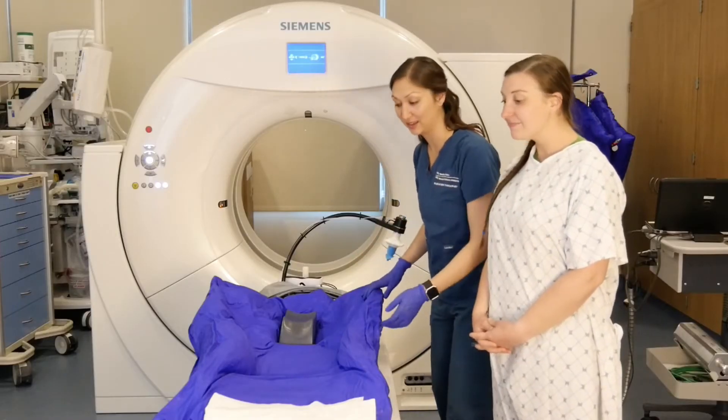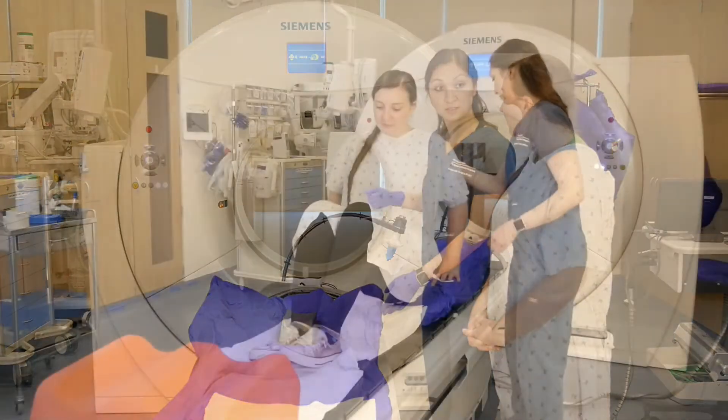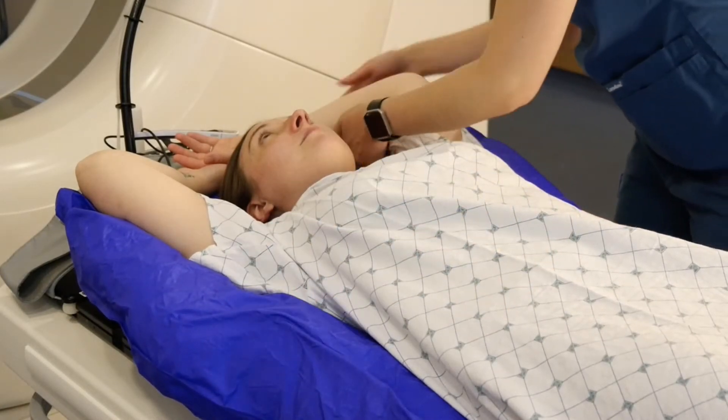During your treatment simulation, the therapist will introduce you to the CT scanner and the SDX device. You will be helped onto the CT scanner table and the therapist will mold a bag to your body to create a setup of your body position.